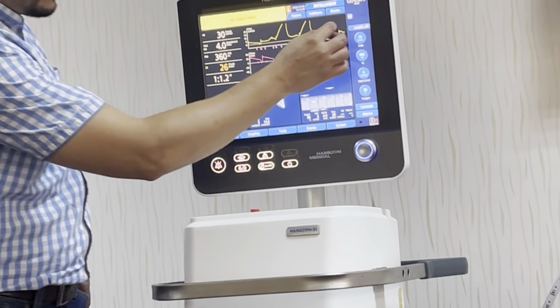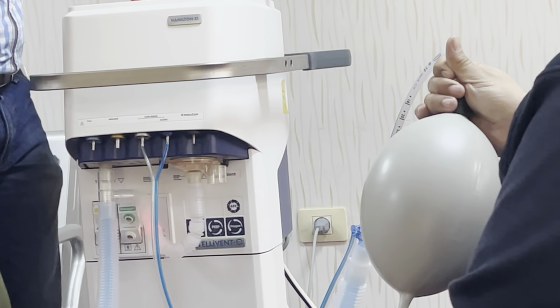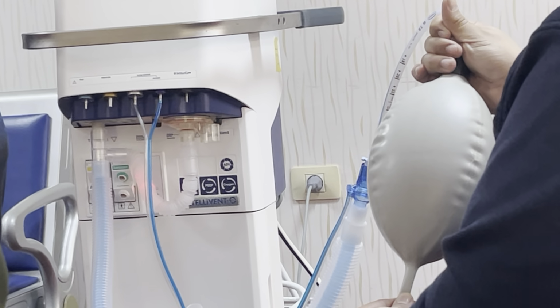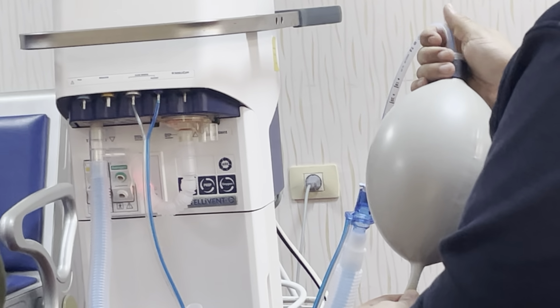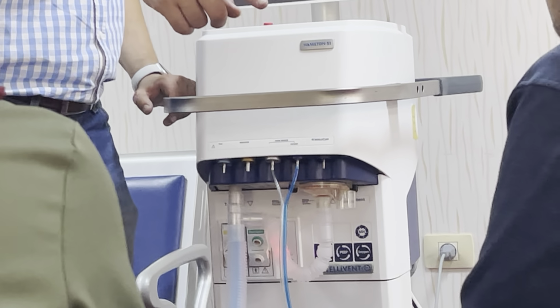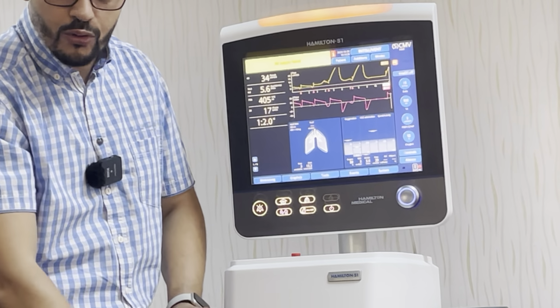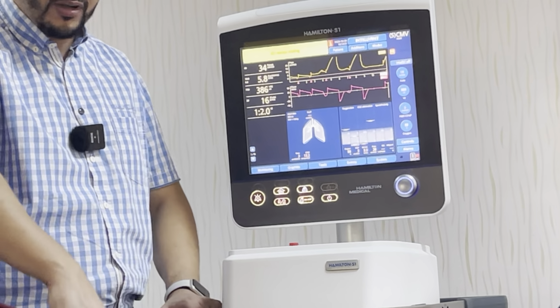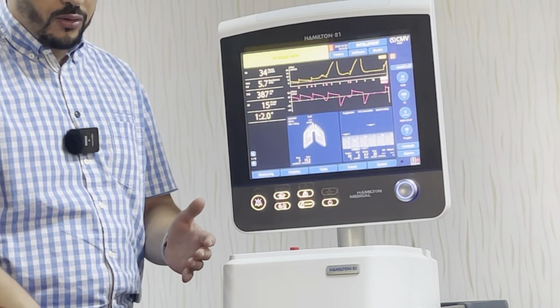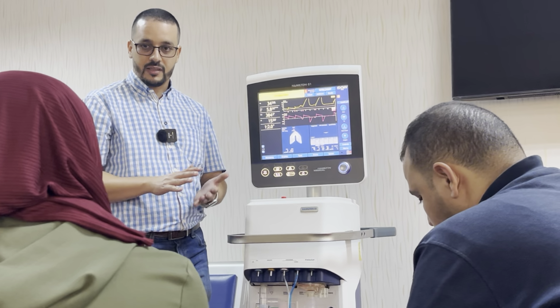I want just to explain how the trigger is working, okay? So this is normally the baseline. It's the PEEP level. How the machine maintains the baseline or the PEEP level inside the circuit. So we have an airflow coming out from the inspiration, going to the patient, and going out from the patient to the machine. So let's say this is a loop from the patient to the machine, okay? It's a loop. So we have normally airflow circulating inside the breathing circuit in order to maintain the level of PEEP, 5, inside the circuit.